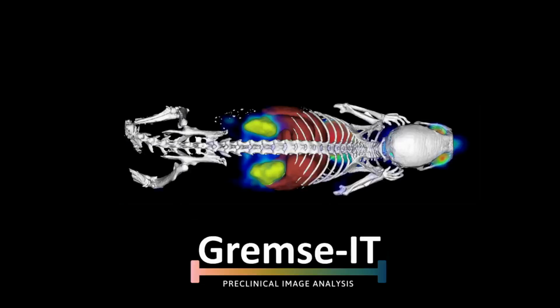Hello and welcome! Did you know that our Imalytics Preclinical software comes with several handy mouse mode shortcuts? In this video I show you these shortcuts and explain how they can make your image analysis workflow much faster and easier. Let's start by opening the software.